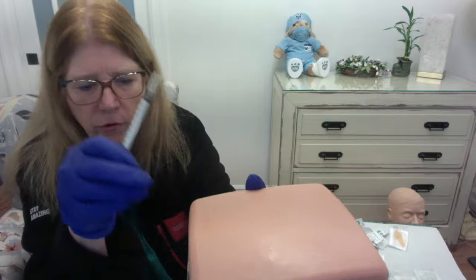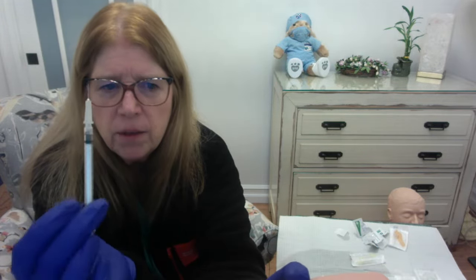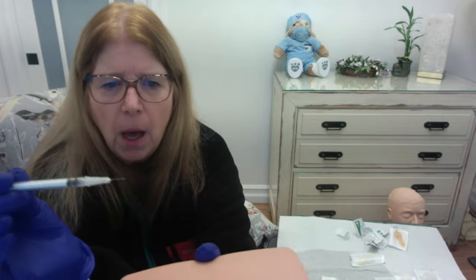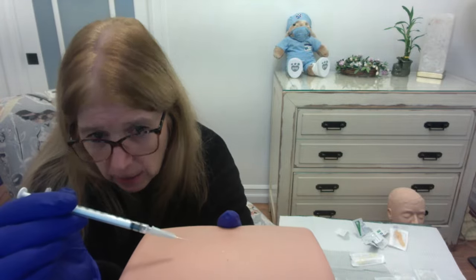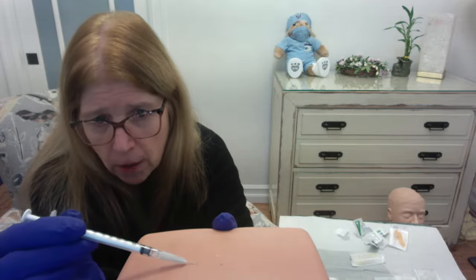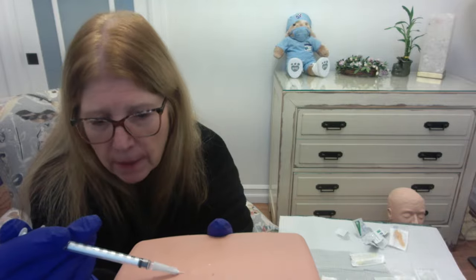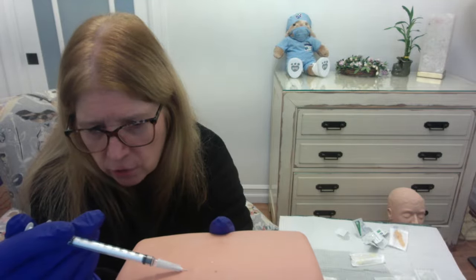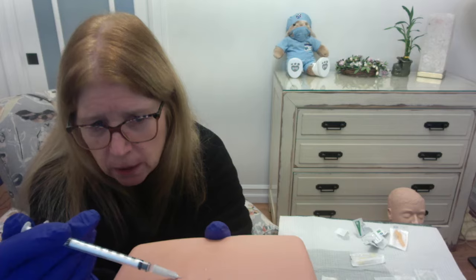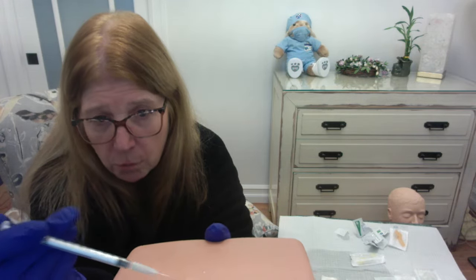So I'm just going to bring this a little closer to the camera, just so that you can see a little bit better, okay? Bevel of the needle is facing me. I'm going to go in at a 15-degree angle, okay? Right underneath the skin. I'm going to push that plunger. That medication is going to go in, and it is going to create a wheal, or very similar looking to a blister. I'm going to remove this needle.